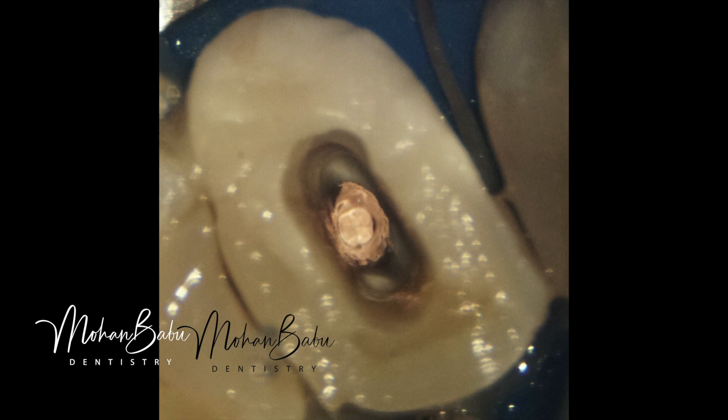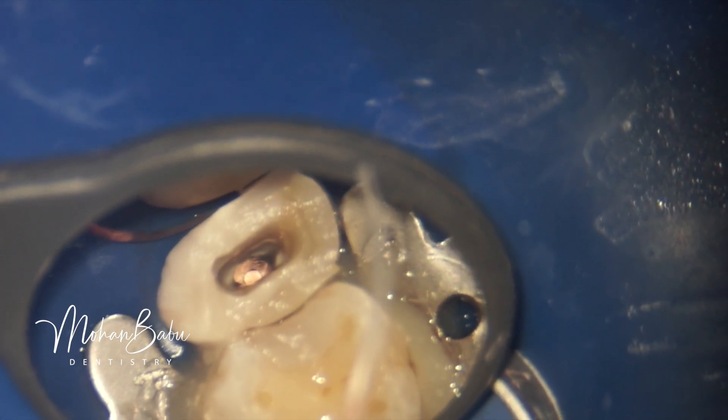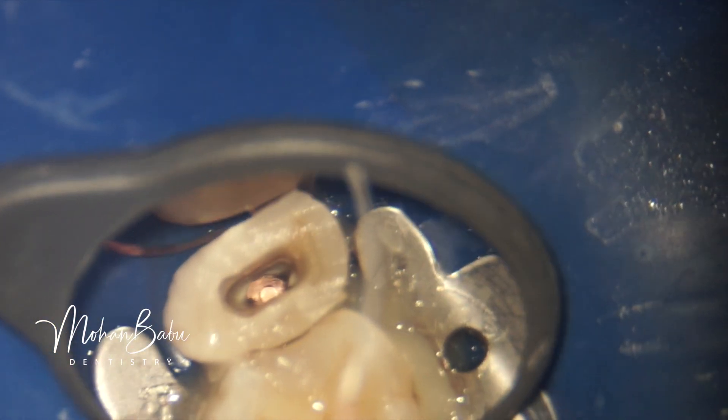Now our new technique follows. If we are doing a post and core, the remaining GIC will be questionable in terms of strength when going for a full coverage restoration. So what we plan is to remove all the GIC material and retain only a rim of GIC in the periphery.